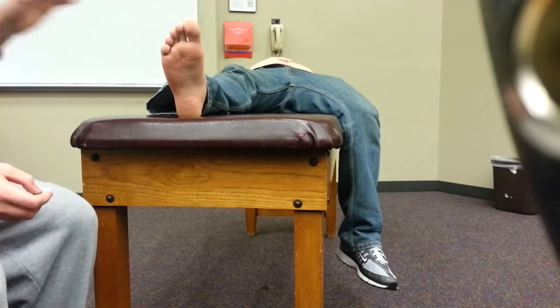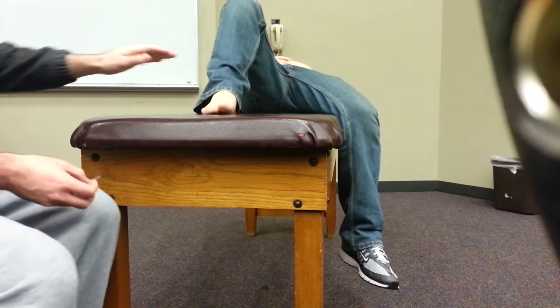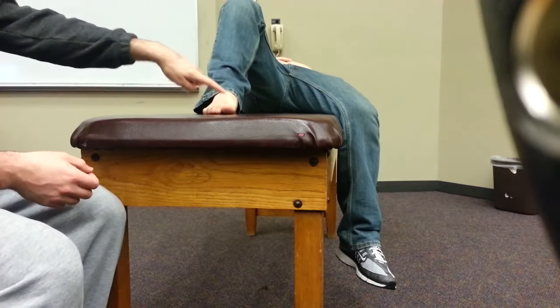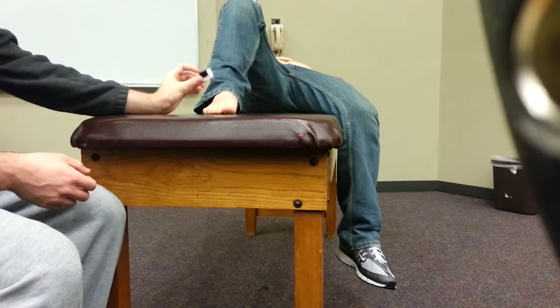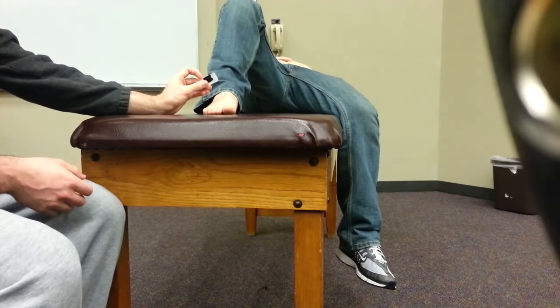Next, my last location that I'm going to test for is going to be on the dorsum of his foot. I like to do it between his large toe and his second toe, just a little bit up on the dorsum. And again, tell me if you feel something.